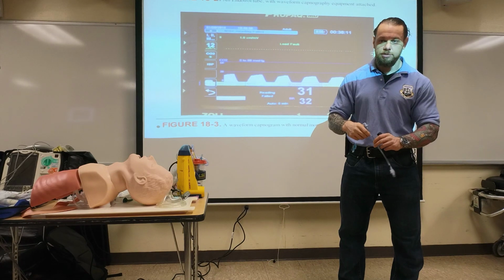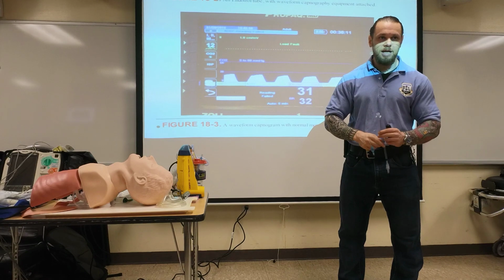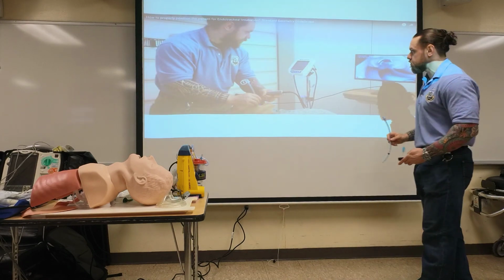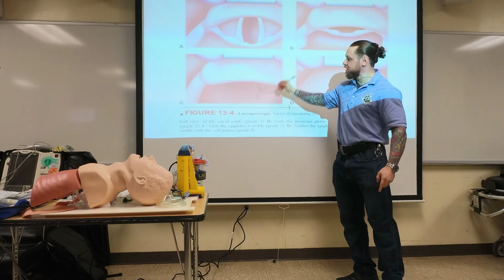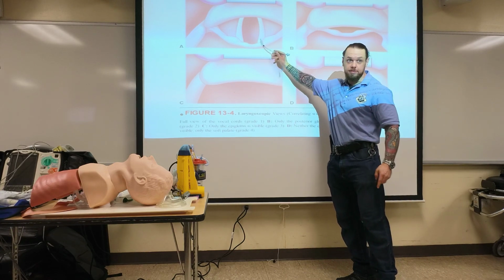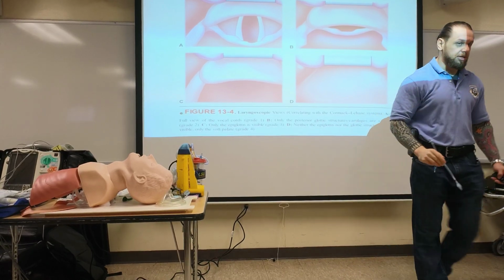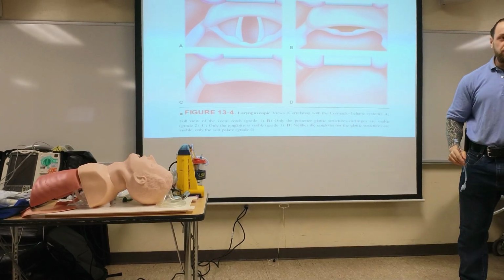So the reason we do lung sounds is to make sure we have left and right. The reason I don't auscultate epigastric sounds is that I never put anything in unless I see this. I never put anything in like this. I never put anything in like this. I only put stuff in like that. That's why I never listen to the belly sounds. You will never see anesthesia listen to the belly sounds. And I'm going to show you the technique.